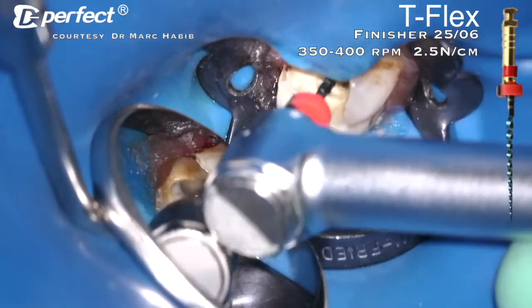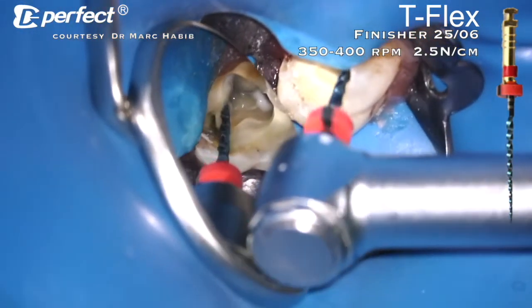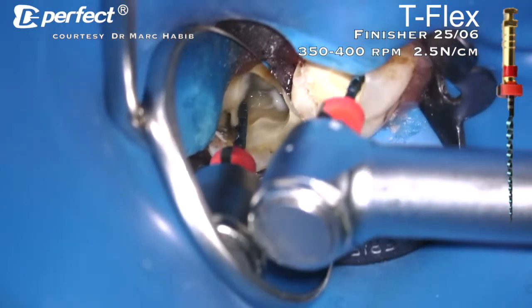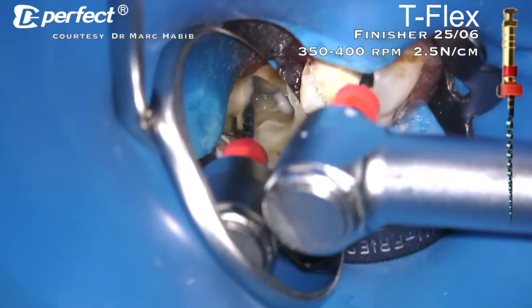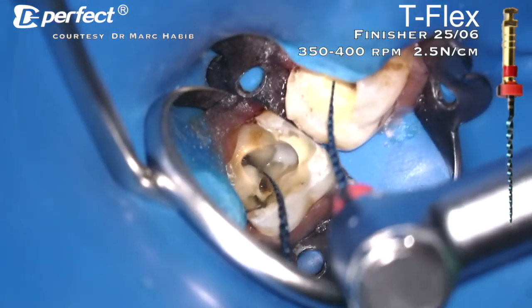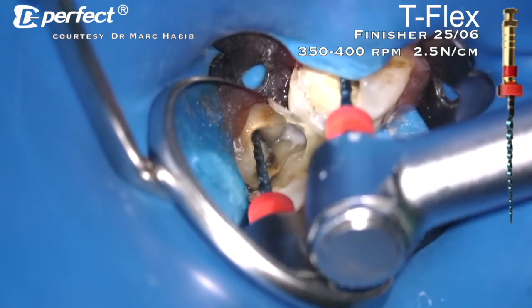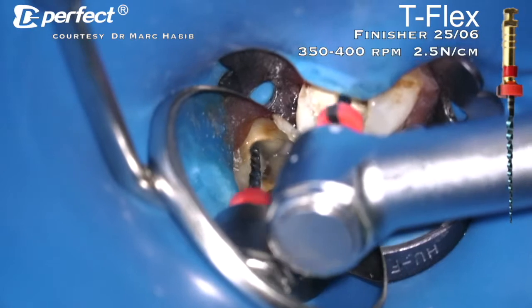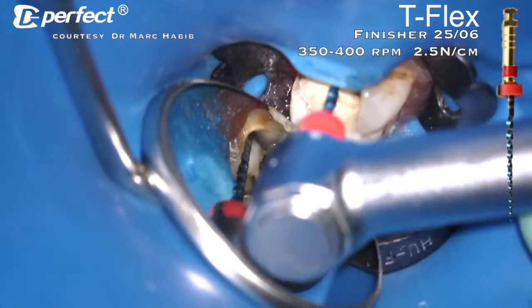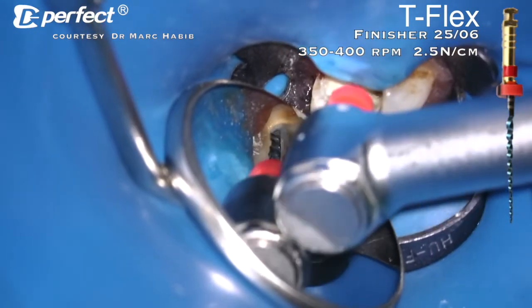Same procedure, we pre-bend the file because we know we can pre-bend it, it's a heat-treated file. And under indirect vision we can access the entry of the mesiobuccal canal. Once it's shaped, we do the same for the mesiolingual canal. Pre-bend the file and try to enter the orifice under indirect vision. We have to apply a brushing motion on the mesiolingual canal, on the mesial wall and on the lingual wall.